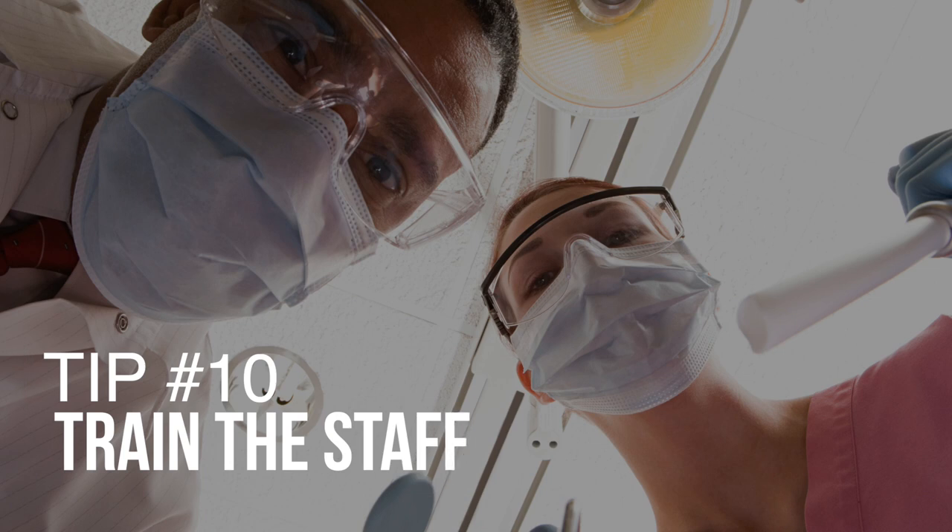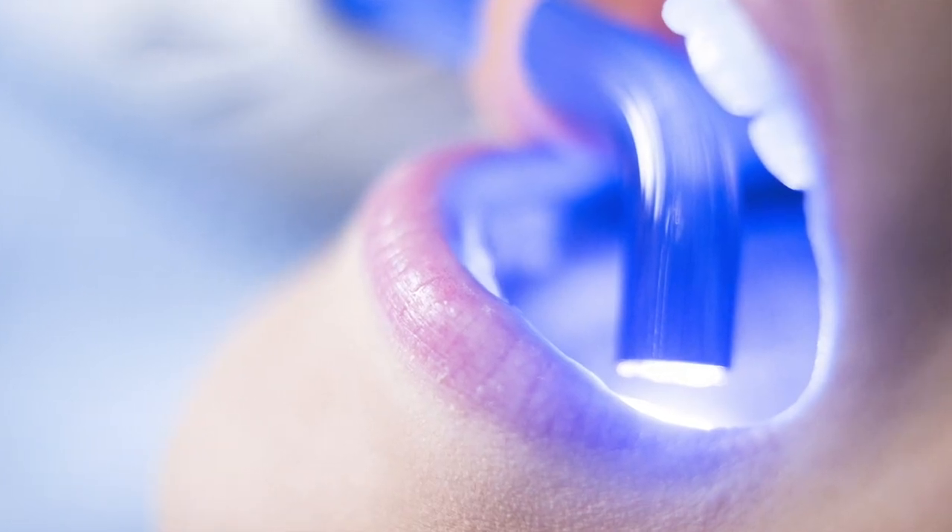Tip number ten: train your staff. Studies have shown that curing a restoration is not as simple as just pointing the light and expecting good results. You need to understand what you're doing and incorporate all the things we've discussed. Training your staff with this mindset — being more aware and paying attention to those details — will lead to better outcomes with your light curing and your dentistry overall.